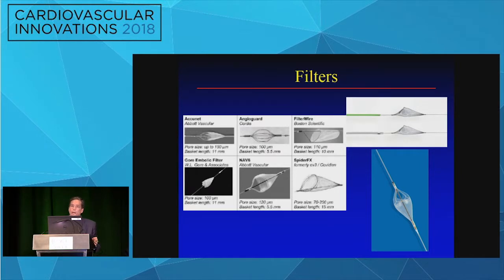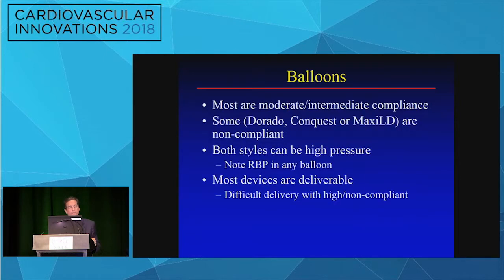While you're doing your work, no matter how you look at it, whether you like to cut, shave, or just do plain old balloon angioplasty, you will have times with distal embolic debris. And so there is a myriad of devices now for distal embolic protection. Again, everybody and their cousin will make something. You don't need them all on the shelf, but you need to have something on the shelf. And from time to time, you will have to pull it. That will cost your margin. Whether you do atherectomy or not, or if you're in an OBL or not, it will cost you on your marginal costs.